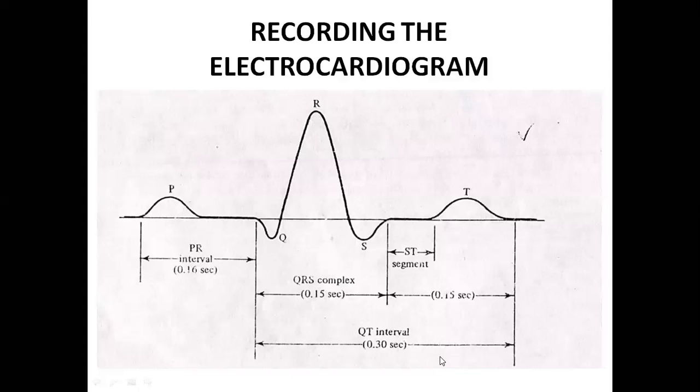Just like this, the PQRST curve is the standard. A 5% plus or minus can be considered, because whenever we go anywhere, by vehicle or on foot, there are some physical activities, so some variation in the PQRST, some changes, will be there.